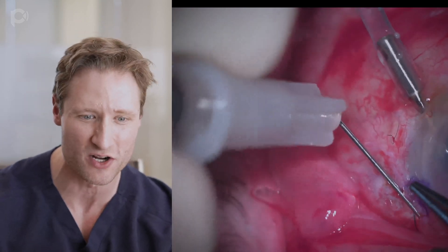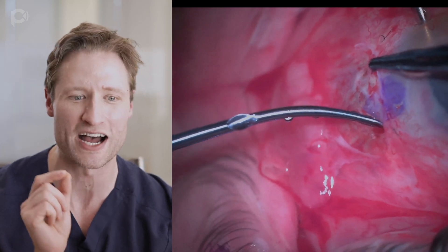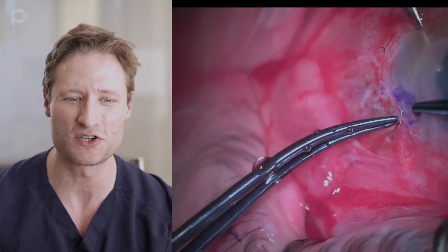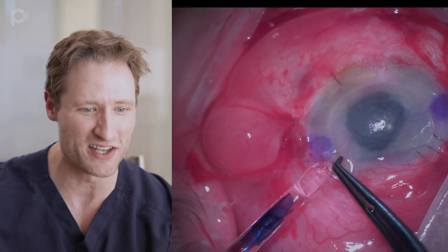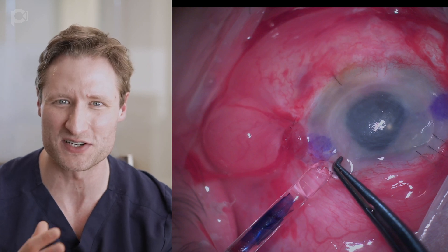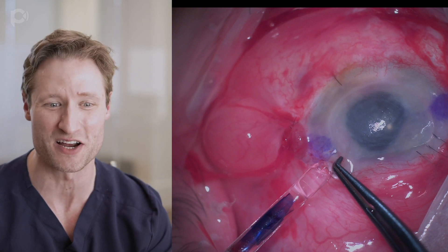You tuck the haptics into partial-thickness scleral tunnels dissected with a 26-gauge needle. Here I'm using that 26-gauge needle and a curved tie to tuck that haptic in. It's super quick and super easy, and it can be done even with very limited to no visibility. You don't have to use glue — we're not using glue in this case. We just suture up the sclerostomies and conjunctiva. Glue is an unnecessary component of the operation.